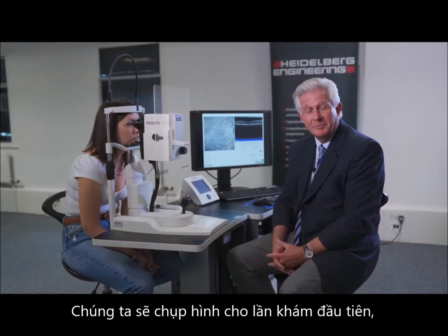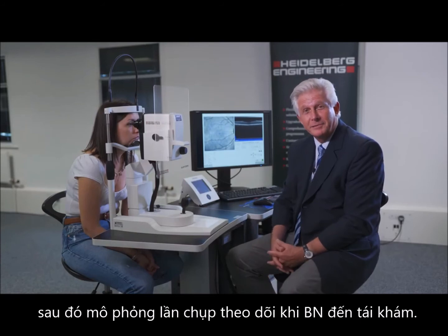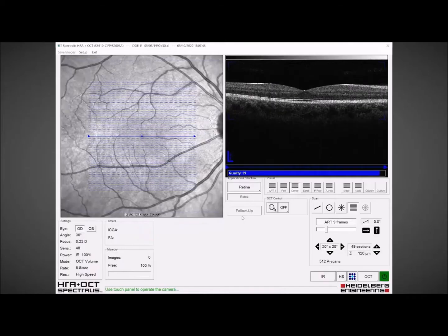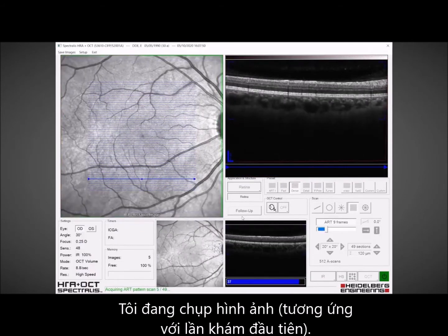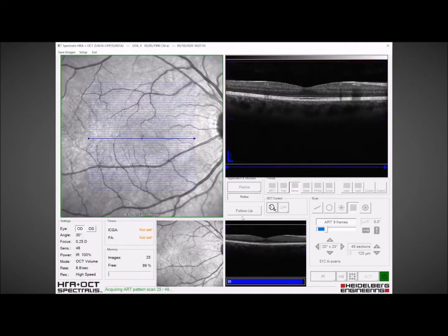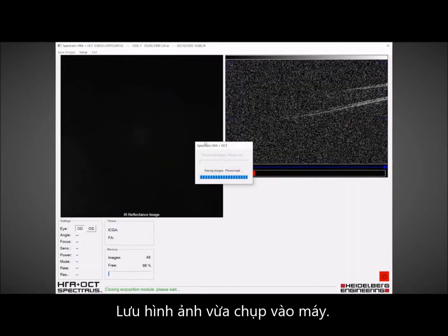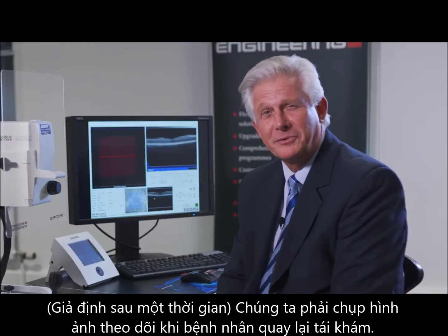We're going to do a baseline scan and then do a follow-up scan and show you the reproducibility. So I'm acquiring my scan and we're done. So let's save that scan. So now let's do the follow-up.